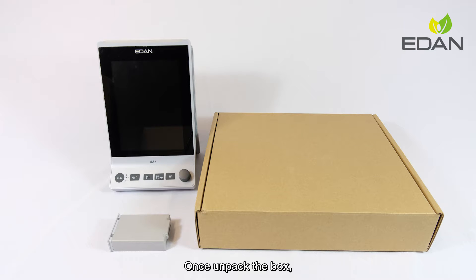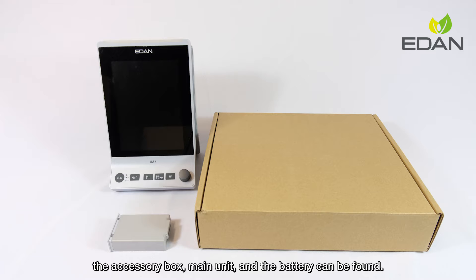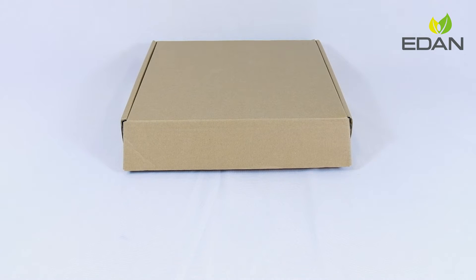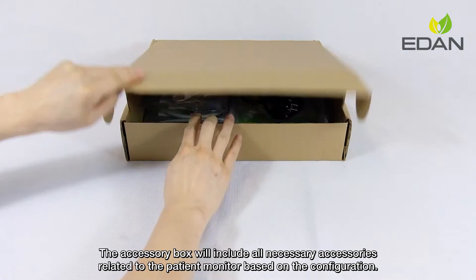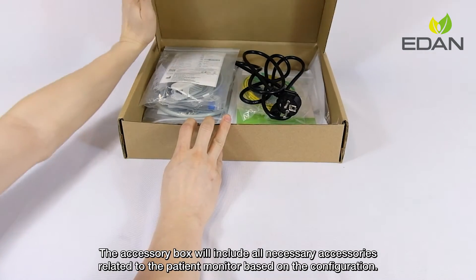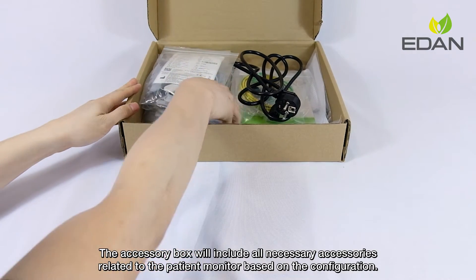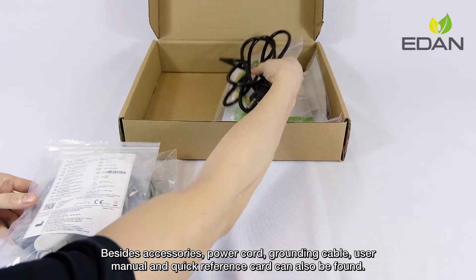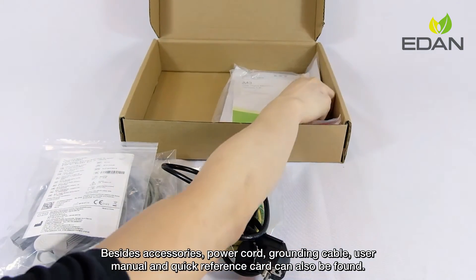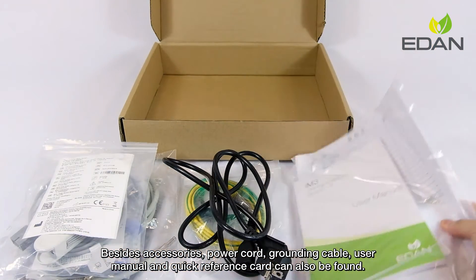Once unpacked, the box contains the accessory box, main unit, and battery. The accessory box includes all necessary accessories related to the patient monitor based on the configuration. Besides accessories, the power cord, grounding cable, user manual, and quick reference card can also be found.